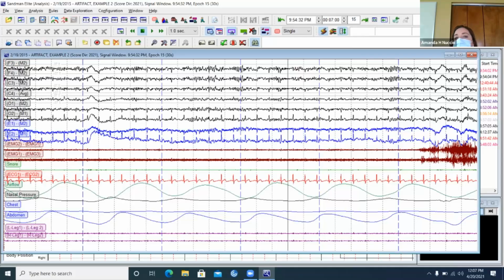And common mode rejection kind of does its thing and eliminates the signal, because the EKG is slightly coming through on M1, M2 as well. You can see it a little bit, right? The thing I notice is the chest belt is pretty flat. You want to adjust it at its source, but you can also try changing the gain.